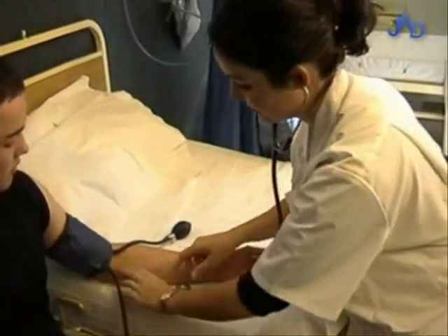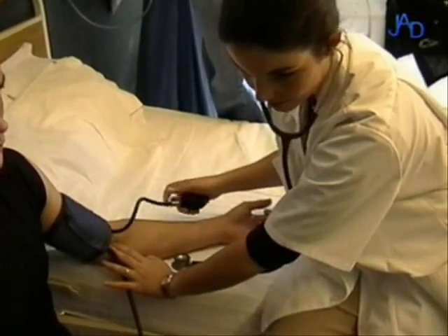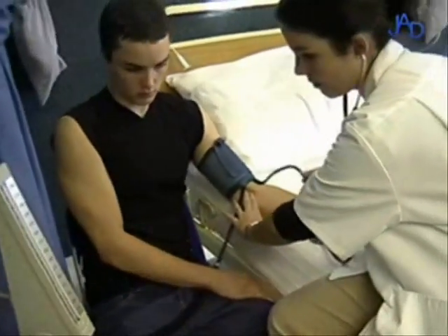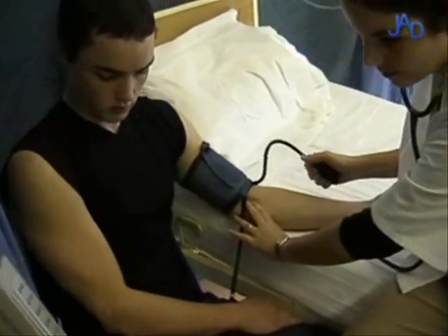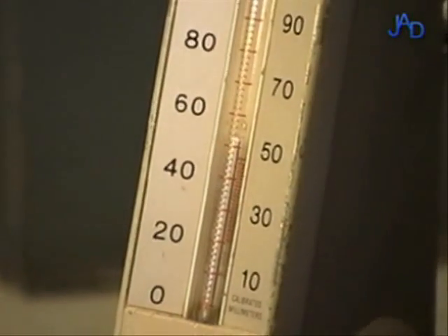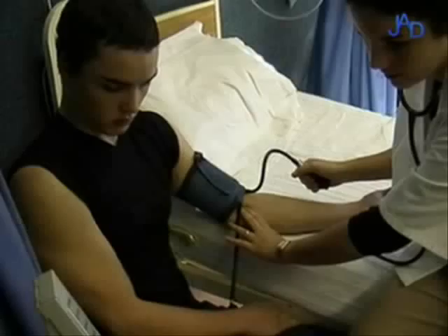The examiner places the stethoscope in the ears and feels for the arterial pulse in the arm. The valve of the bulb is closed and the cuff is inflated somewhat beyond the point where the pulse cannot be felt anymore. The rising column of mercury indicates the pressure of the cuff.